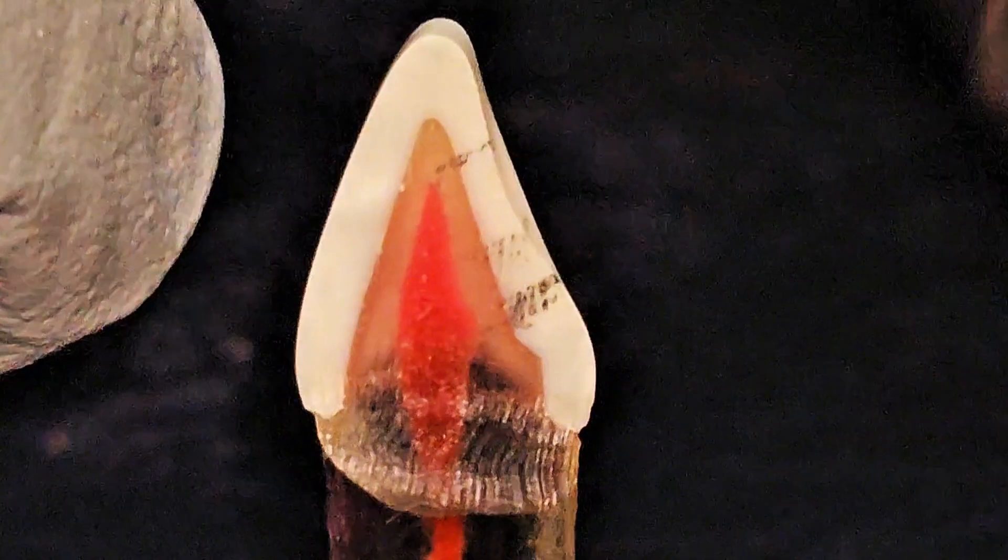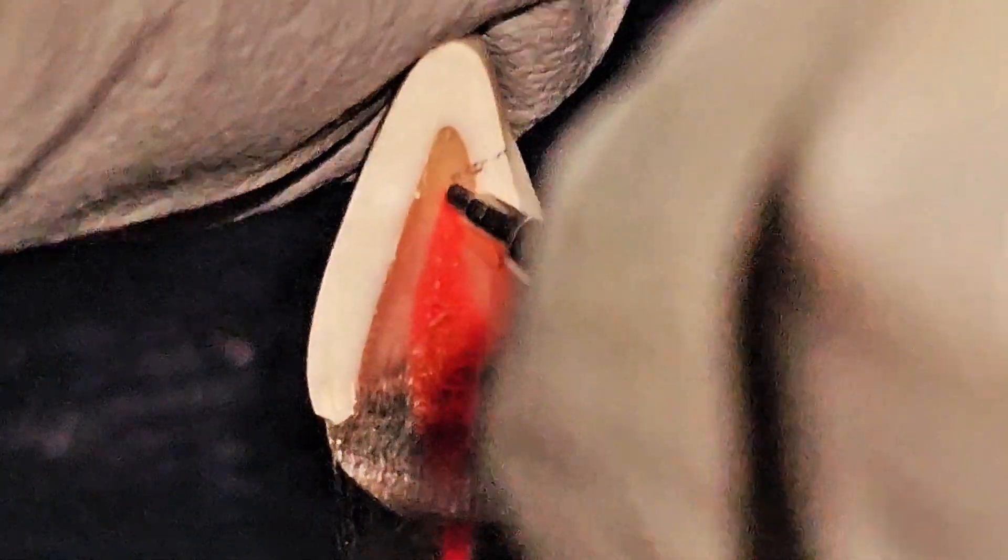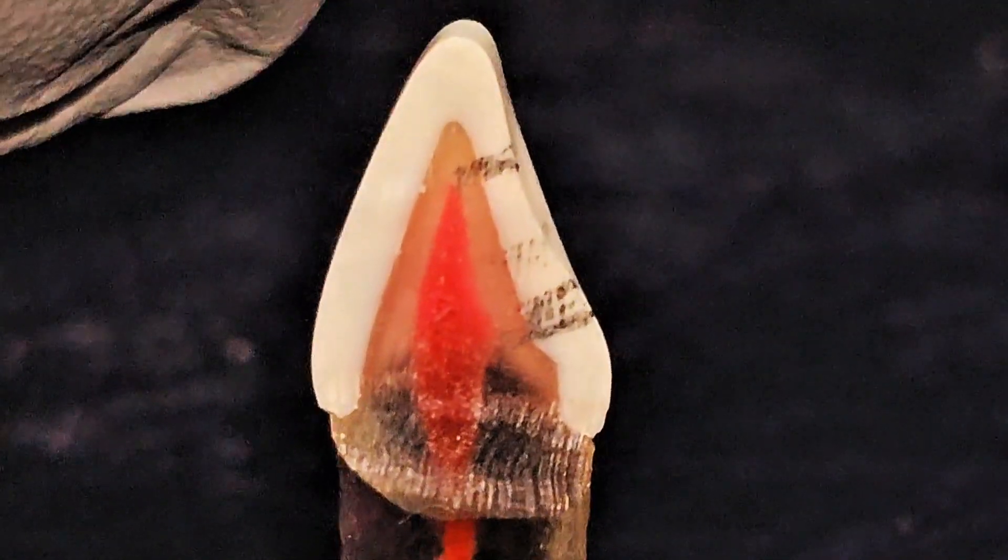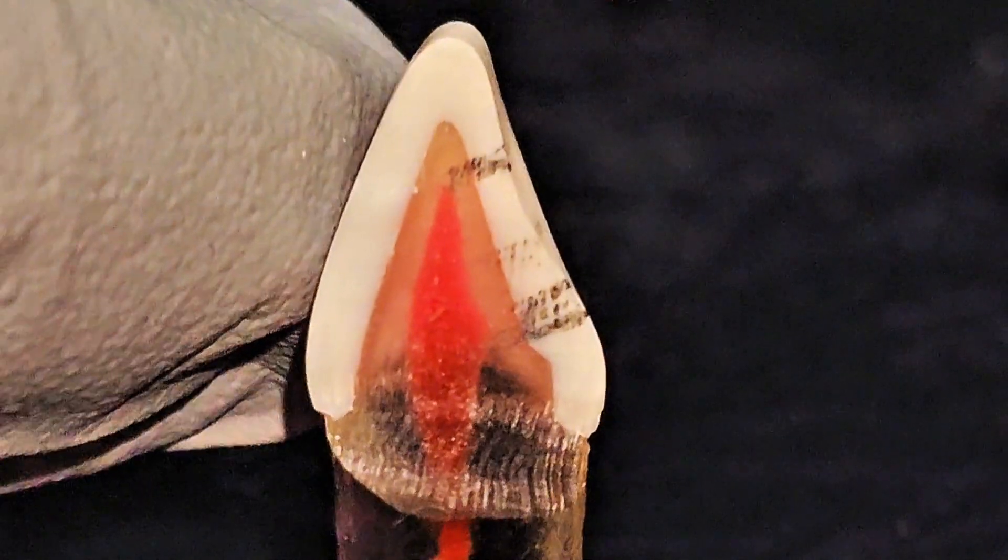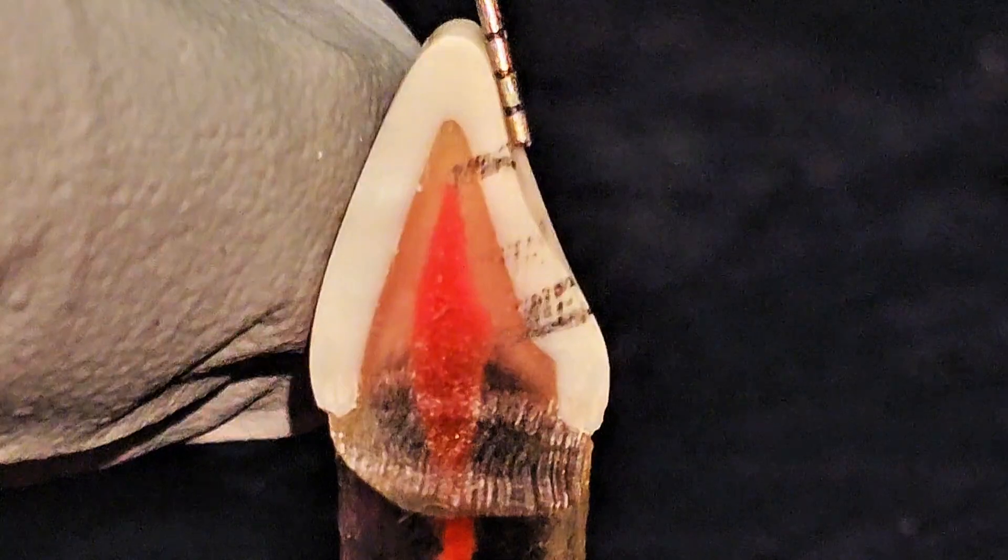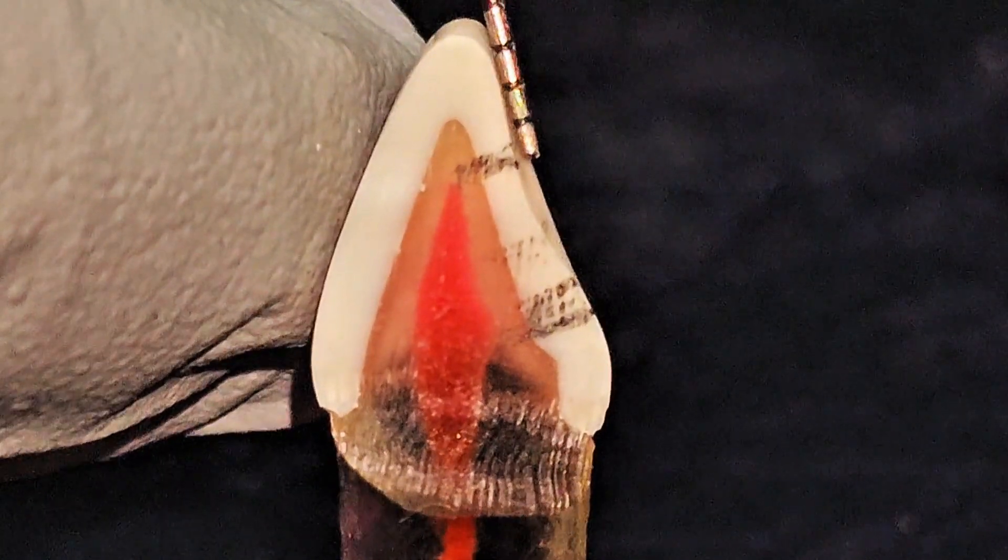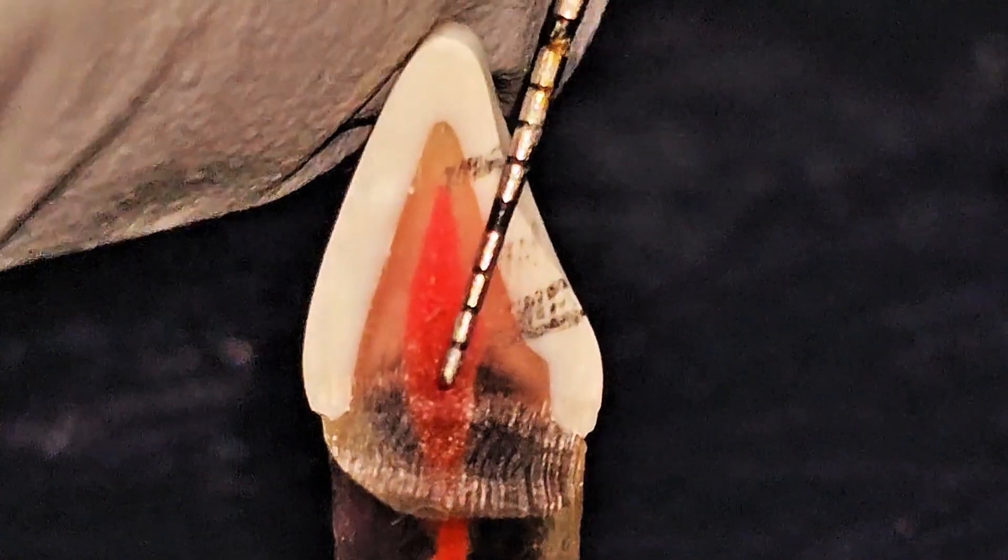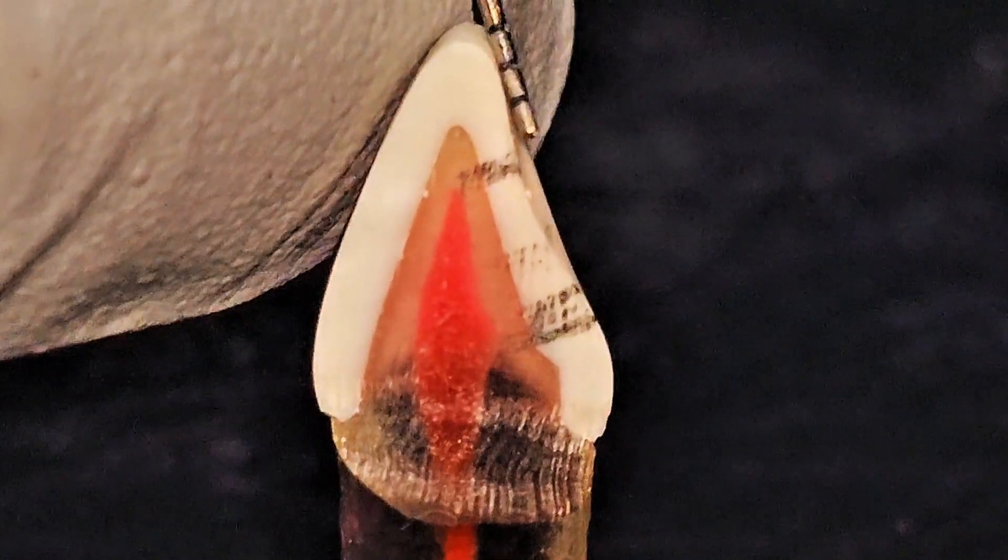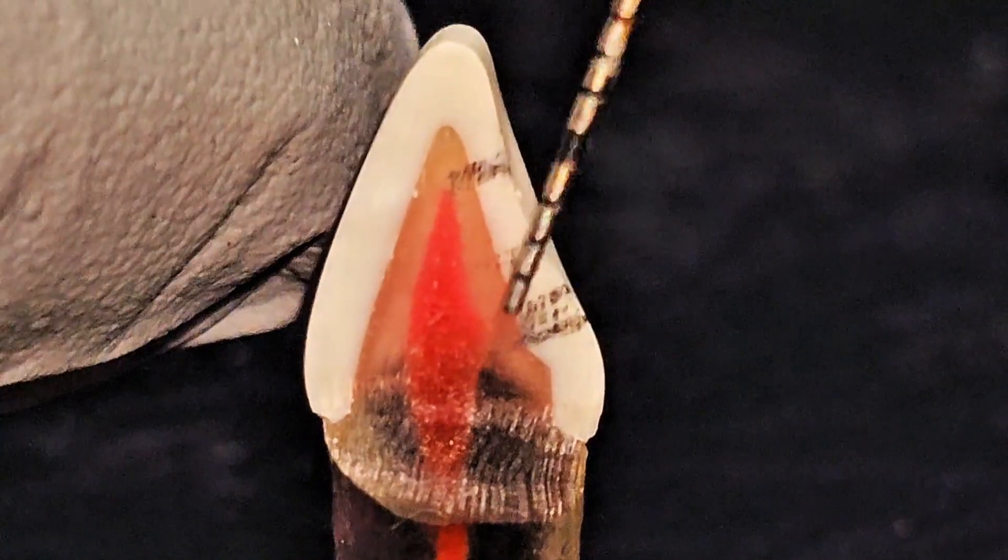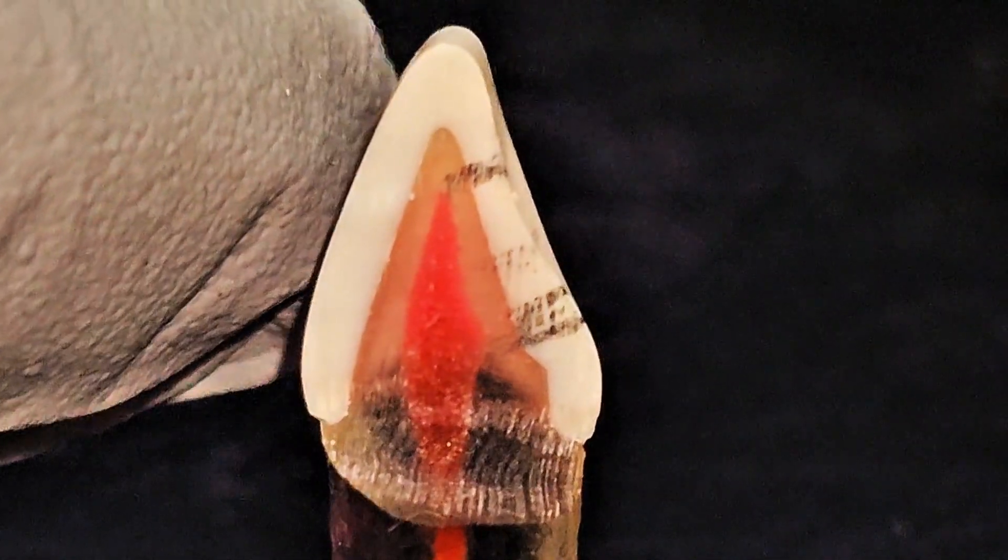We can open it up more here like this, and for here we can probably make it at an angle. In length it will be like about 5mm. This incisal edge - we need to be careful because as you are using the rotary instrument or file you might gouge this area, you might damage this area causing it to be into the 2mm limit and causing you to fail. So we don't want that to happen, so let's try to drill with the real bur.